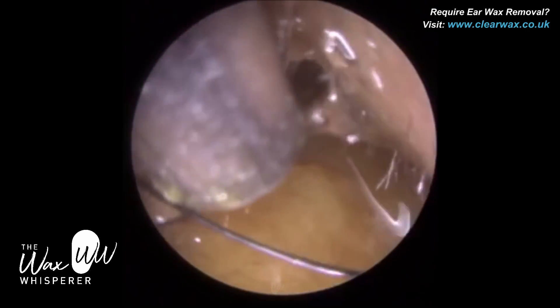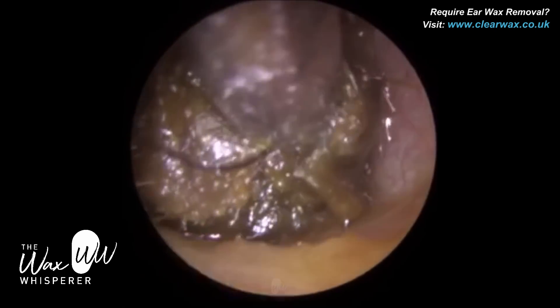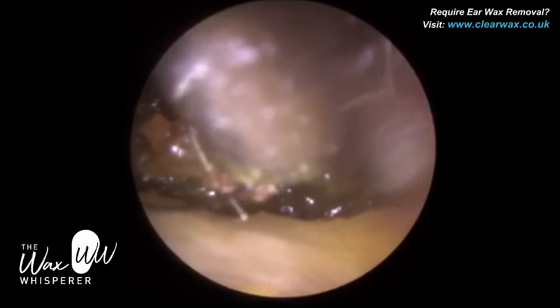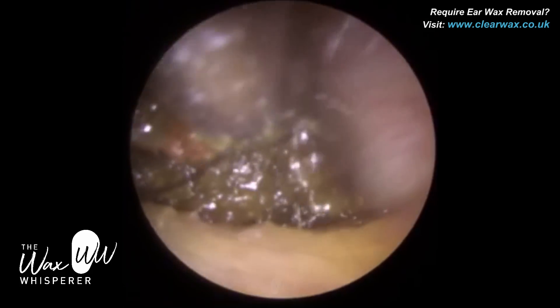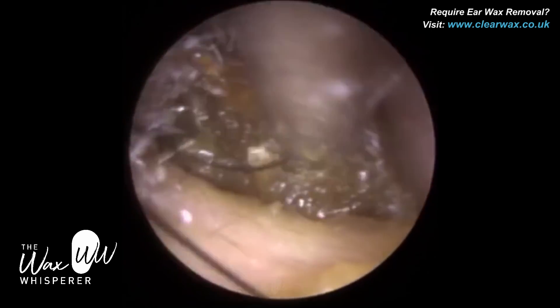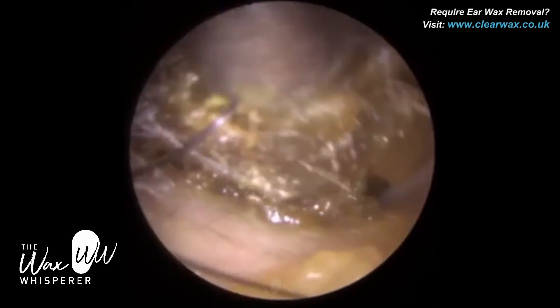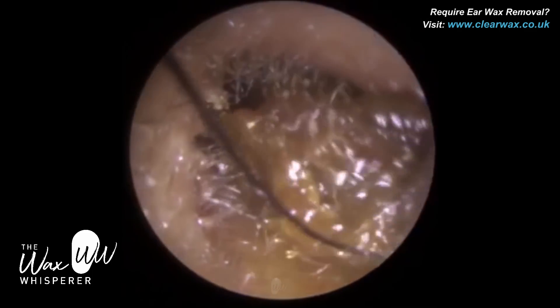Whenever I perform procedures on people I know, it's a bit weird — you get more nervous. I don't usually get nervous performing wax removal because I really enjoy what I do and I like to think I'm quite proficient at it. But when it's friends or family you just think, oh God, I hope I don't cause any injury or trauma. My friend is also an audiologist — we were co-audiologists together.